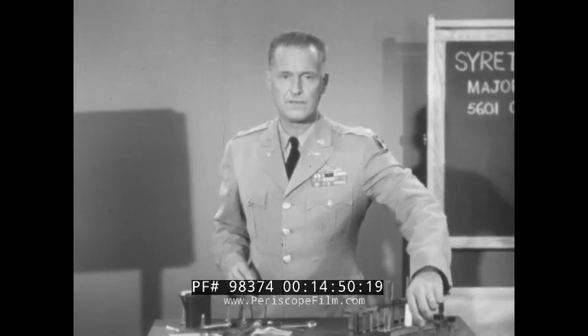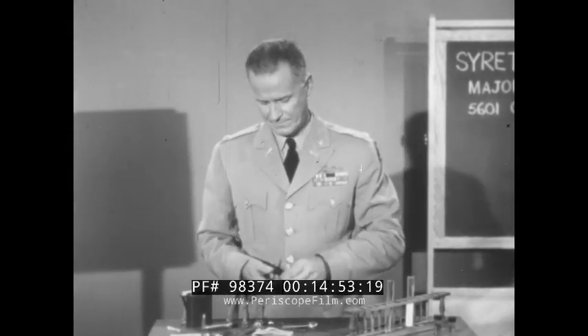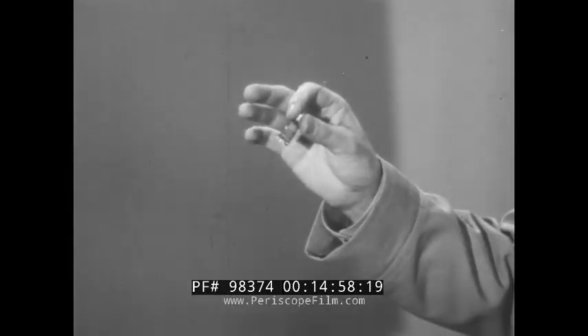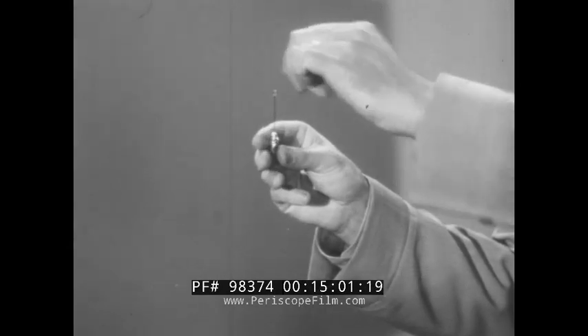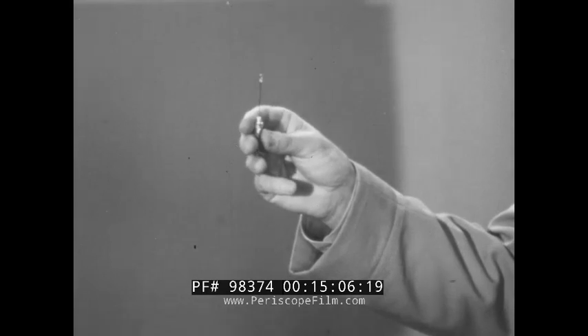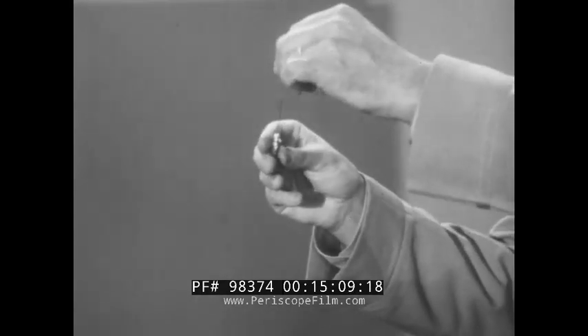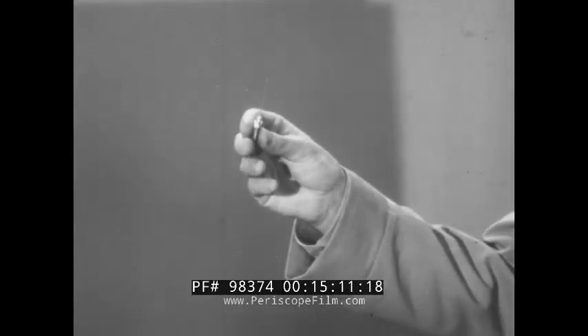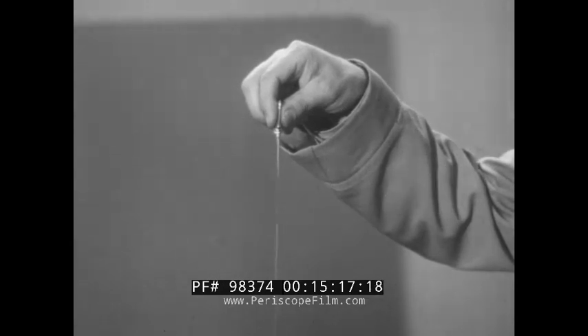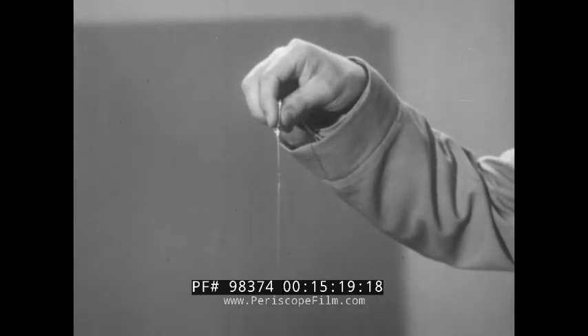Now let's nail down the points you need to know and remember on the use of injection instruments for your own personal self-aid. First, the atropine syrette: hold it by the hub. Make certain you have broken the seal before removing the wire stylet. Push the needle all the way in, straight up and down, and squeeze the tube until all the atropine is emptied into your muscle where it should be.